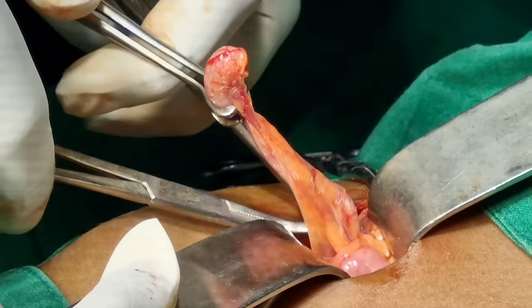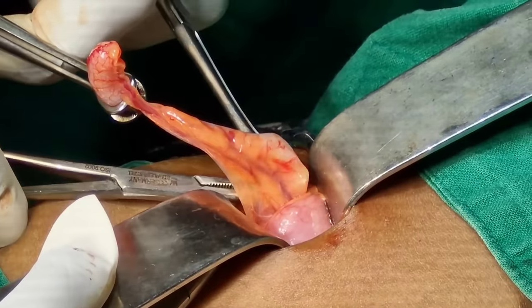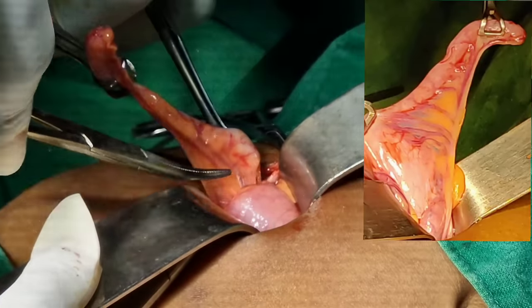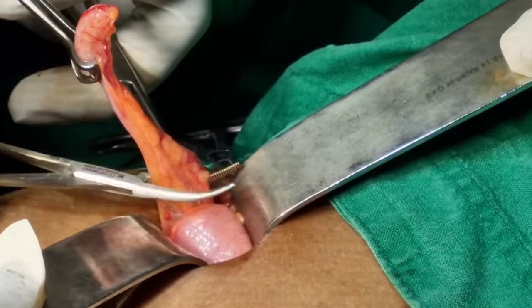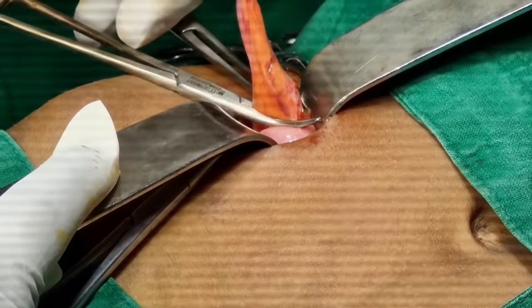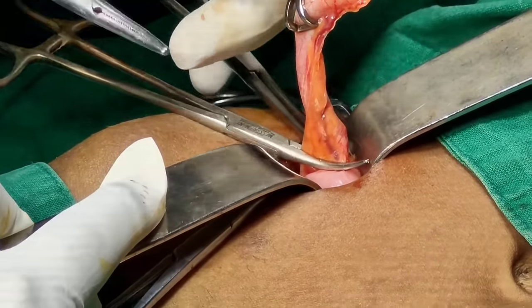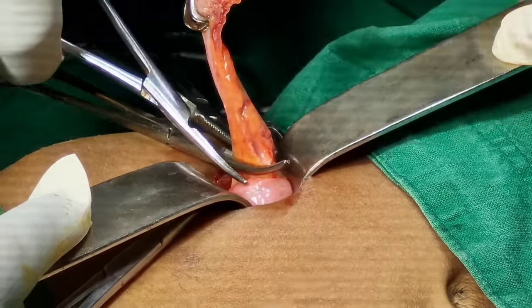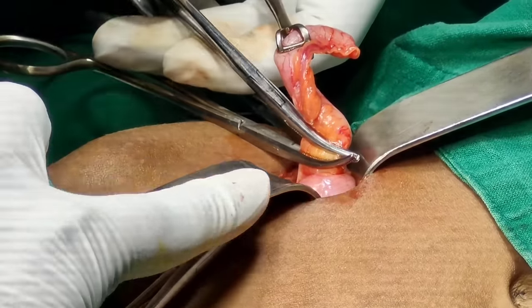You have to separate the meso-appendix very carefully because it contains the appendicular artery, which is an end artery and a branch of the ileocolic artery. Using hemostatic forceps — see how it is being used here — after creating a hole in the meso-appendix, apply two hemostatic forceps and cut it between the two forceps. Then, towards the body side, you have to ligate the meso-appendix. It should be tight enough so that not even a small amount of blood is trickling.